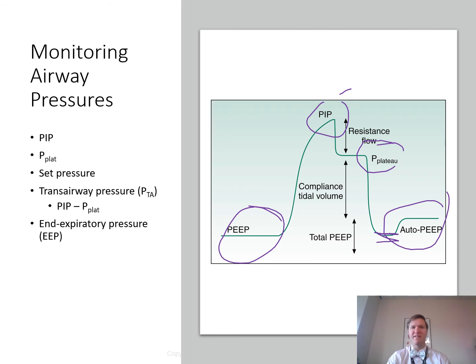So most ventilators have a control for this. The expiratory pause usually lasts for about a half second. Now, can it go for a little bit longer? Absolutely. But traditionally, with the auto-PEEP, we're looking at about a half second. So when we're looking at this, you can have it go up to 1.5 seconds. And then even some vents can allow you to go up to 15 to 20 seconds. I don't know what patient's going to tolerate that, but it will allow you to.